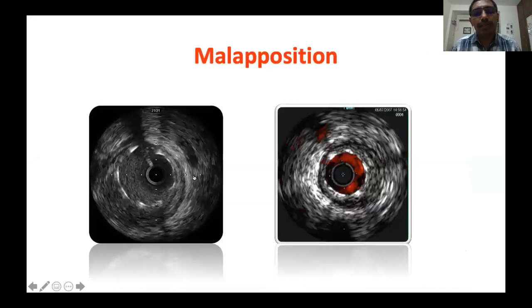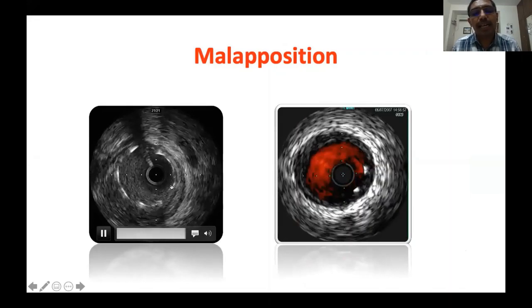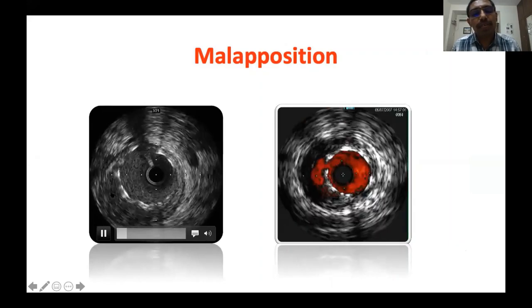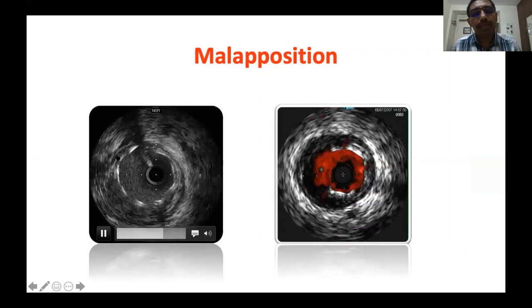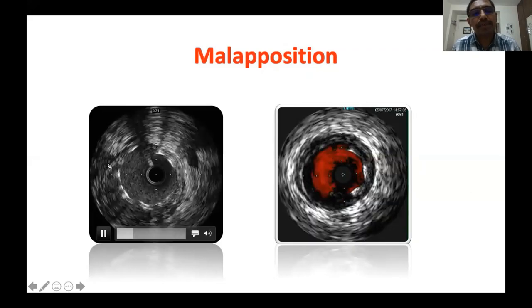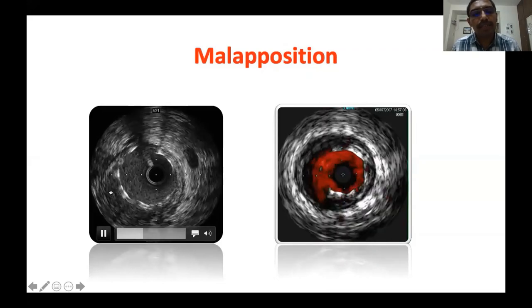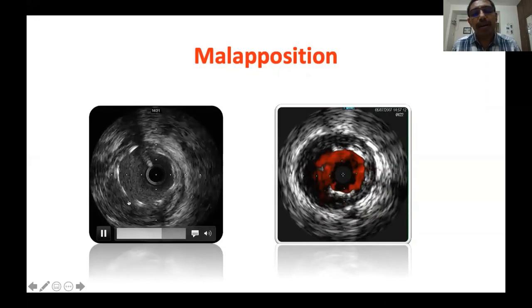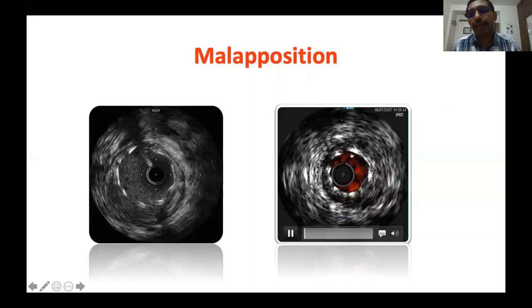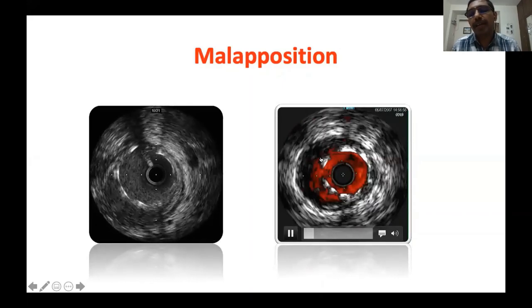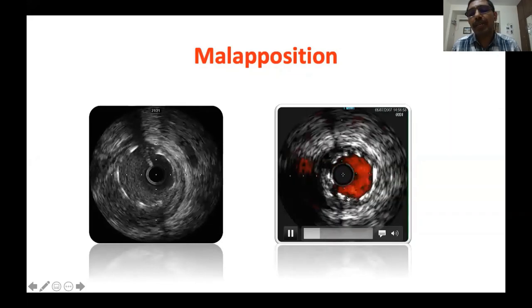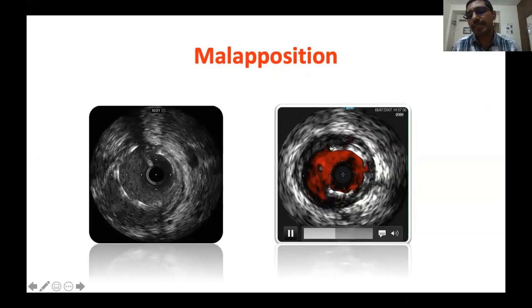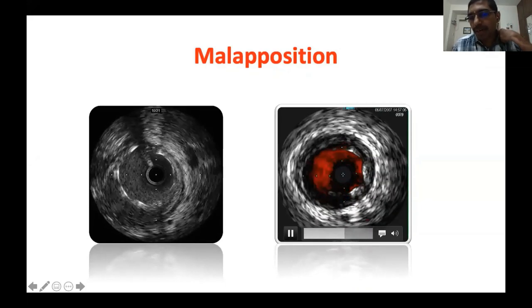Malapposition is lack of contact between stent struts and the vessel wall, with movement of RBCs in between. Here you see stent struts, the intimal surface, and movement of RBCs — the typical appearance of malapposition. With the VOLCANO system there is a special function where you can see Doppler movement outside the stent struts — this function is called ChromaFlo and it exists only with the solid-state system from Philips.